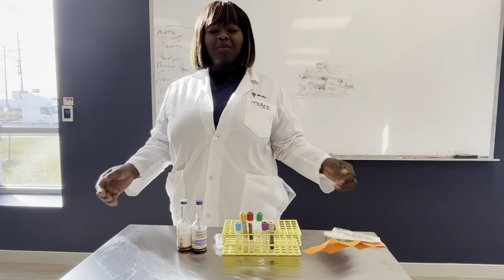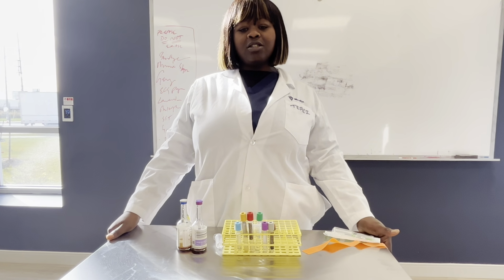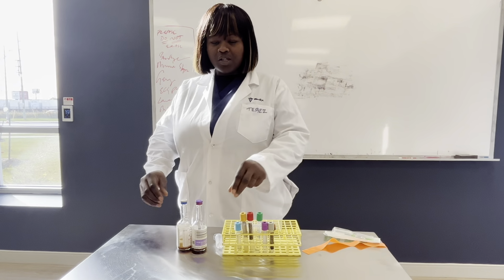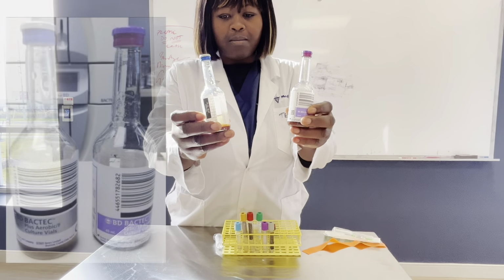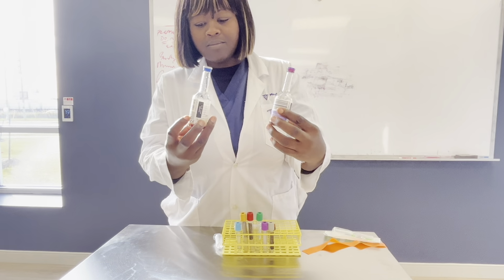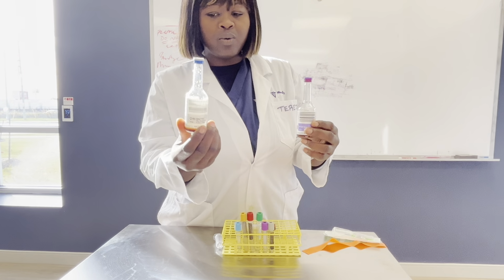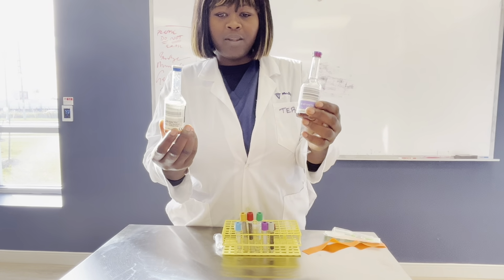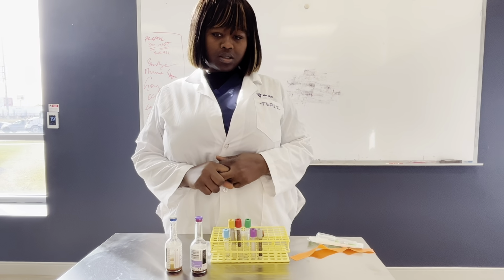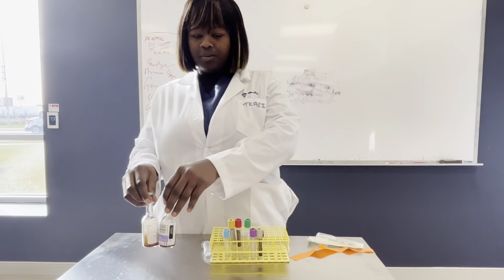So next, I'll provide detailed information on the most common tubes that we as lab techs use when performing routine blood collection in Canada. So the first tubes are these, blood culture bottles or vials. When you're drawing the blood, the first one you have to do is aerobic. So you do aerobic first before anaerobic. Blood cultures check for infections in the blood and help the doctors to figure out the real infections. So these are really important.